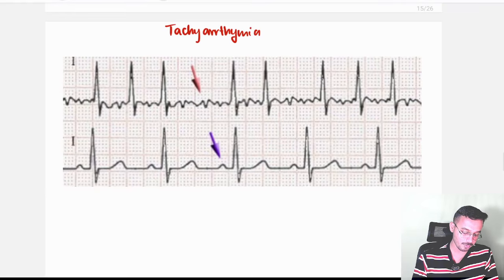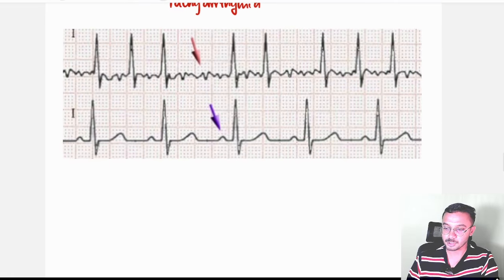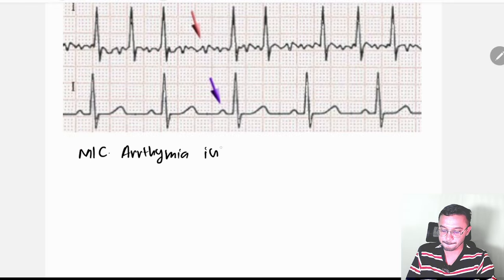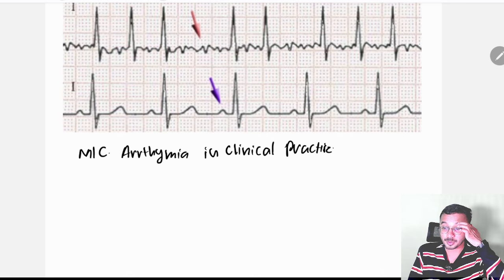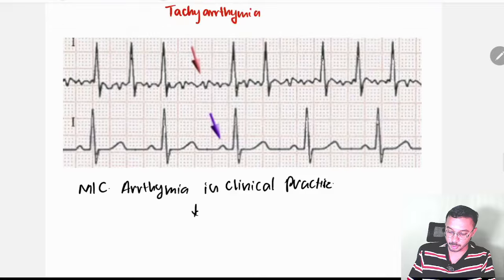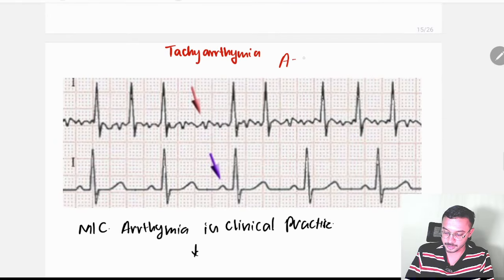And next we move to one of the most important arrhythmias, the tachyarrhythmias, where you can expect questions from these aspects onwards. When you come to tachyarrhythmia, if they ask the most common arrhythmia in clinical practice, don't answer ventricular fibrillation or ventricular tachycardia. It's atrial fibrillation that is the topic of discussion. This is atrial fibrillation. So I will teach you ECG, don't worry.